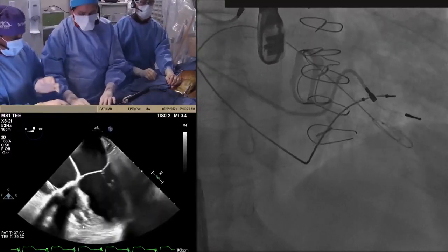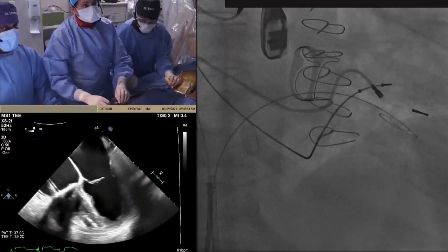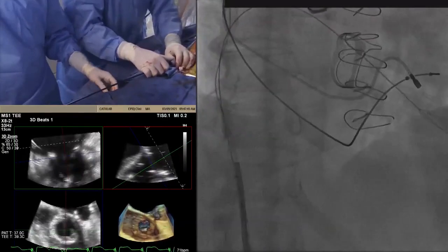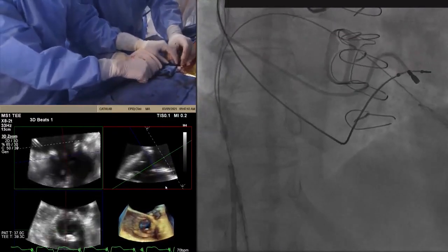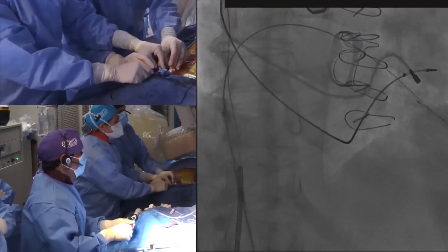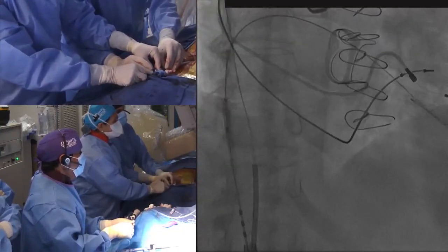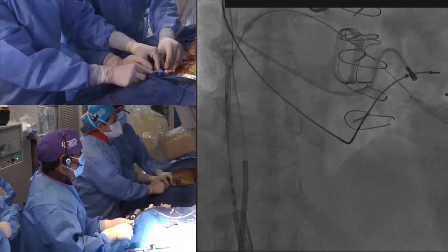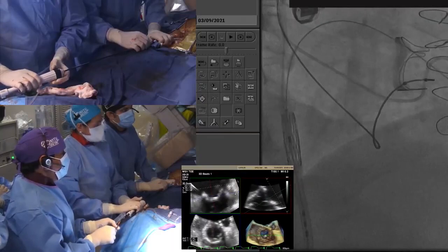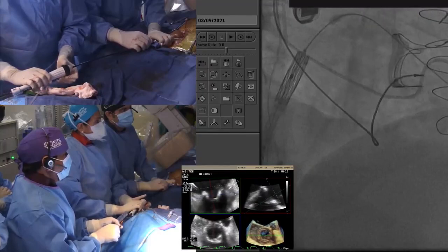Okay, now I'm taking everything out. Yeah, better. You see this much nicer trajectory now. Okay, we are pulling the sheath back so we can load the valve. That's good. That's great. You are going a little bit inside. You see that? I'm advancing. Okay. Yep. Good. I'm flexing. Yep. Lots of flex and gentle back tension on the wire.